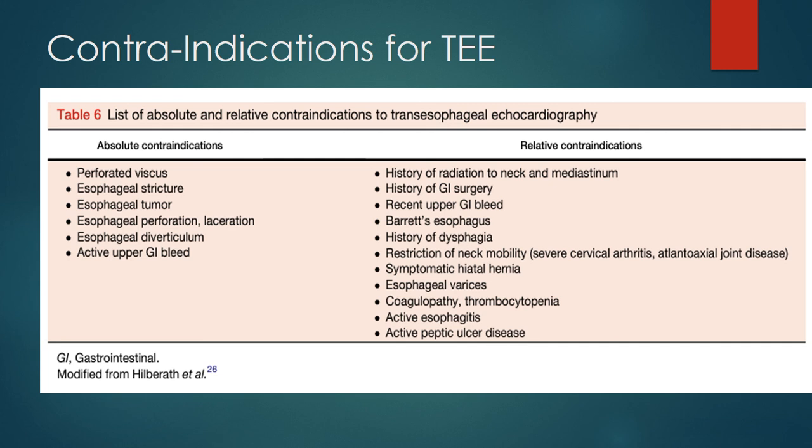So for these patients, they need to have an EGD prior to you doing the procedure. Oftentimes you can do it at the same time. So I will have the gastroenterologist dilate the esophagus, and then I'll come in right afterwards and we can do it all, and the patient only needs to undergo sedation once.